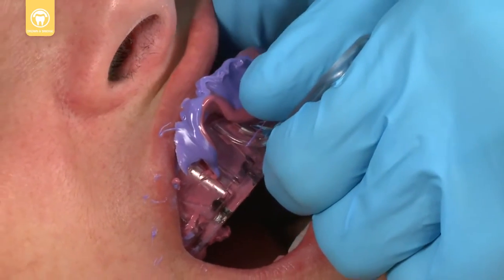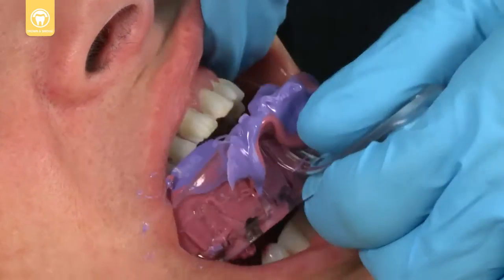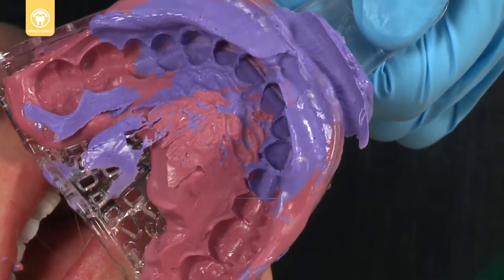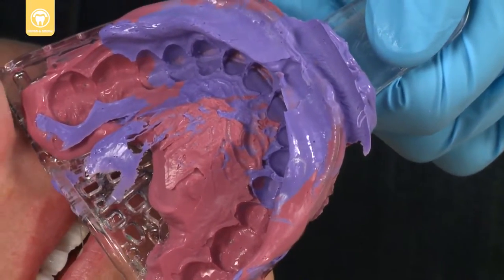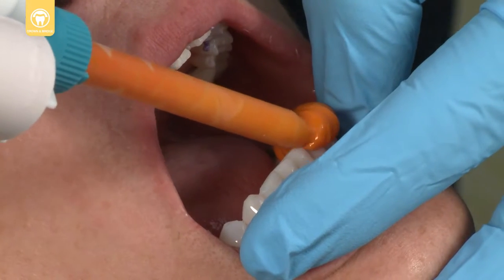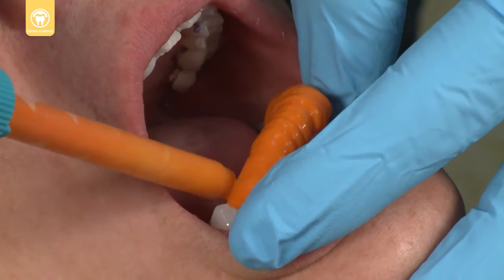Leave the tray in the patient's mouth until the material is fully set. After it has set, remove the tray. Check the margins and preparation for air or saliva bubbles. After the final impression is inspected, remove the second retraction cord. Use ClonBite to make an accurate impression of the bite registration.